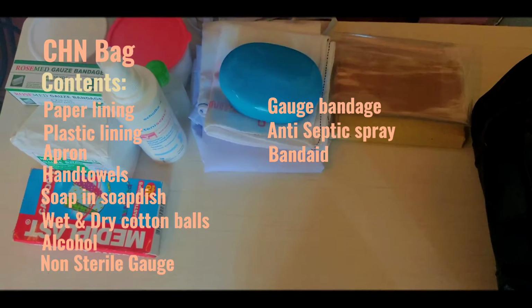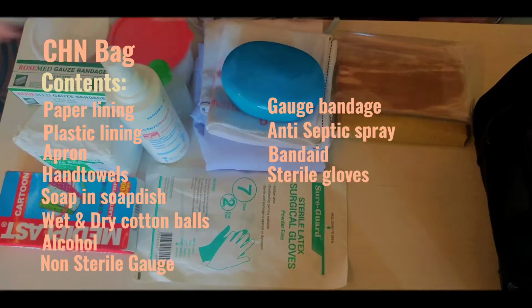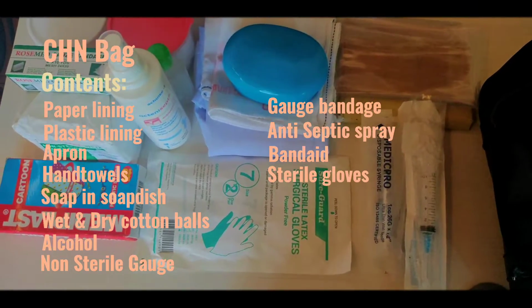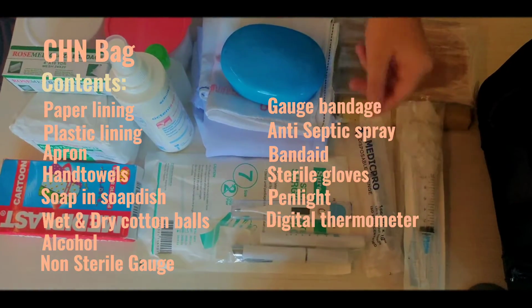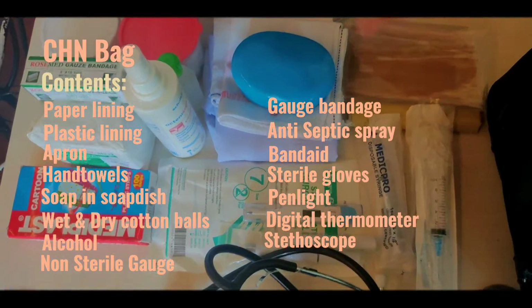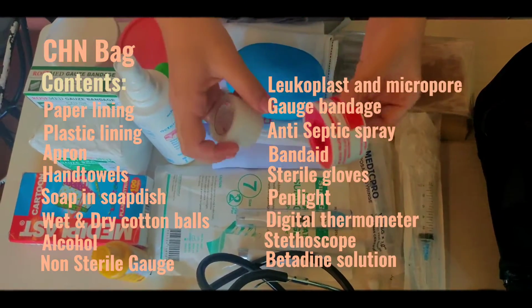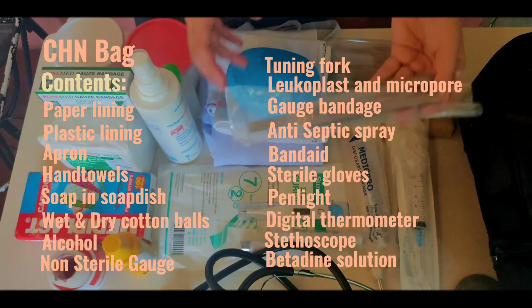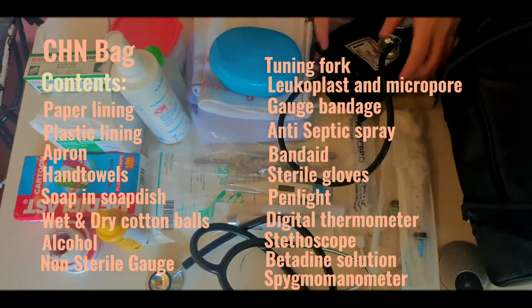band-aids, sterile gloves, disposable syringes, our pen lights, digital thermometer, our stethoscope, betadine solution, our leucoplast and micropore plasters, and also our tuning fork. And lastly, we have our sphygmomanometer.